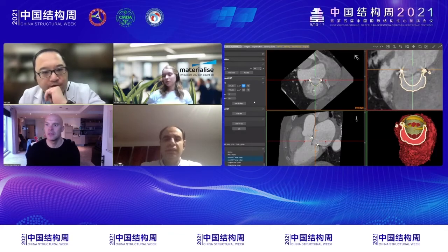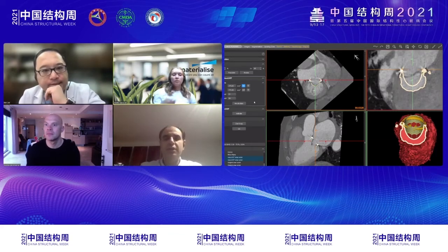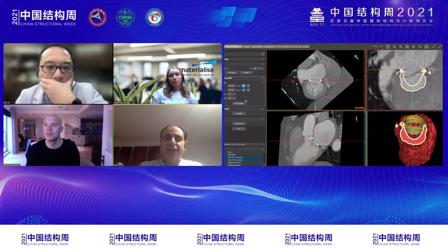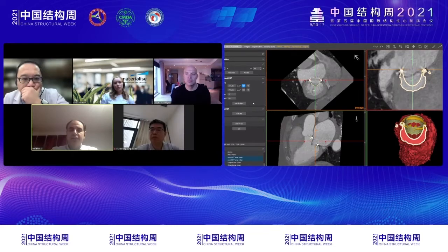That might change. Can I ask you a question? Actually, I have two questions for you. Is it an AI-based algorithm? And the second one, if I understand well, it's a volumetric segmentation here. It's the opposite of the center line segmentation that we are used to work with. Can you comment on that?